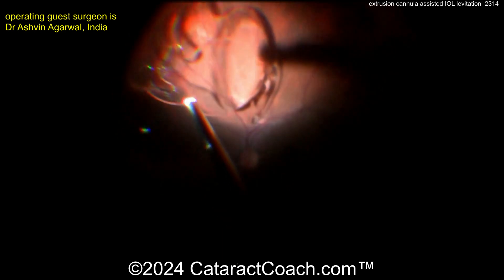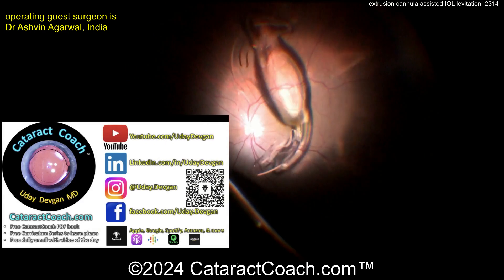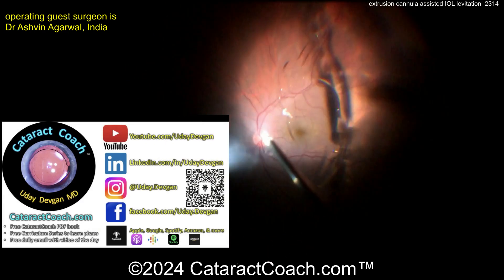So a glued IOL is a good idea. Here's the three-port vitrectomy — get all the vitreous out. Get this lens untangled; you can see the IOL is entangled in vitreous. And now there it is.